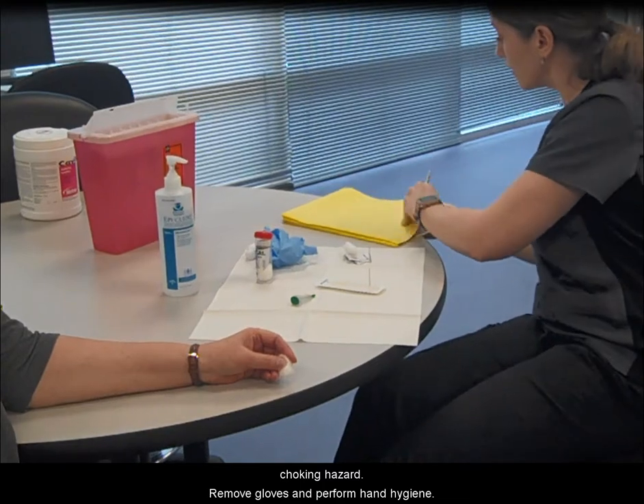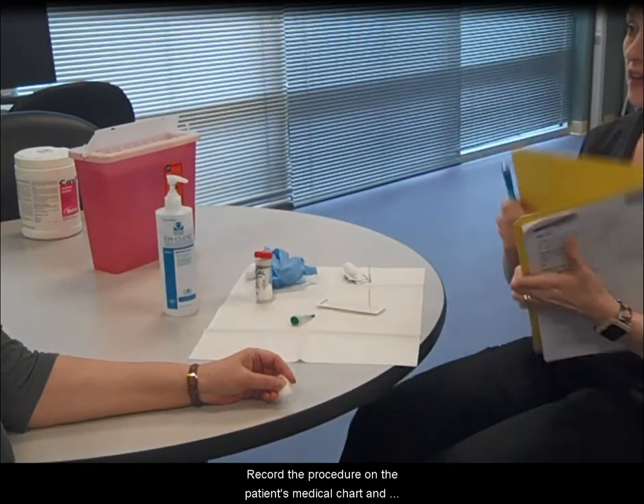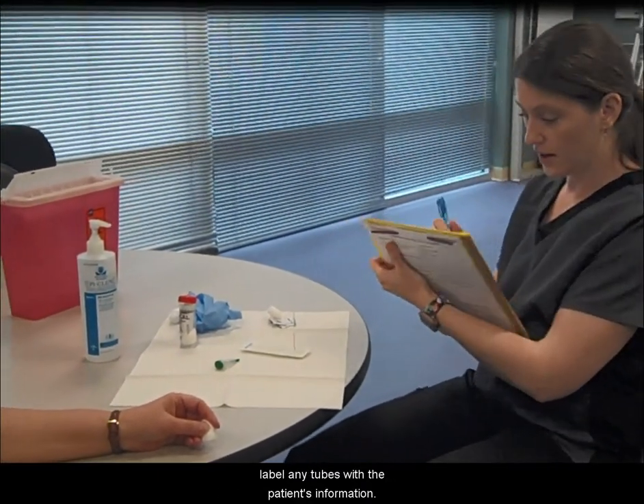Remove gloves and perform hand hygiene. Record the procedure on the patient's medical chart and label any tubes with the patient's information.